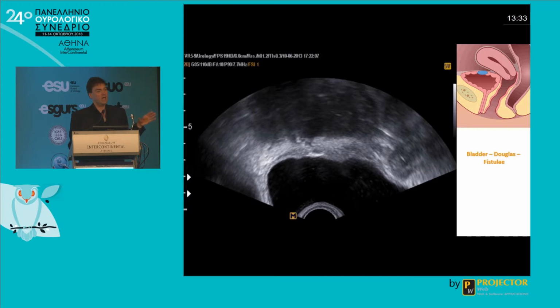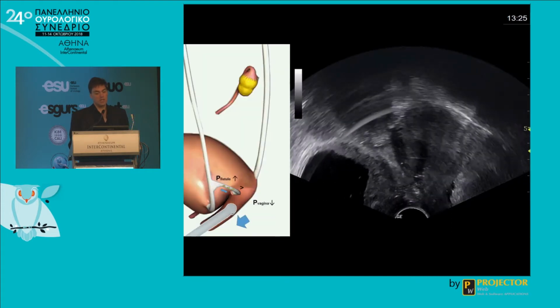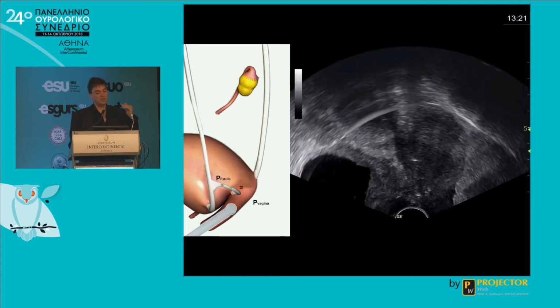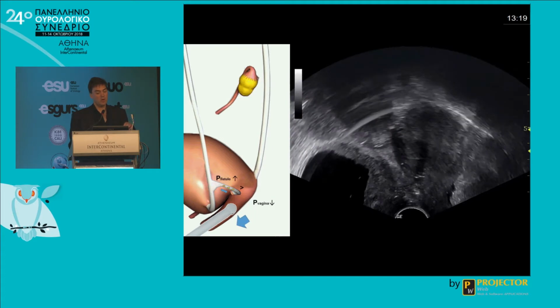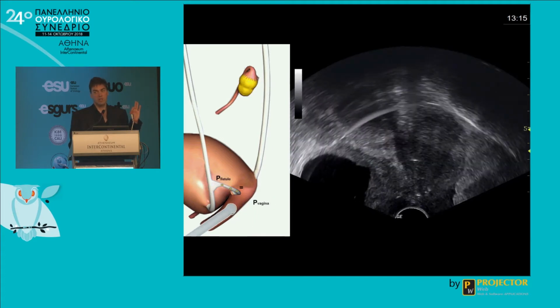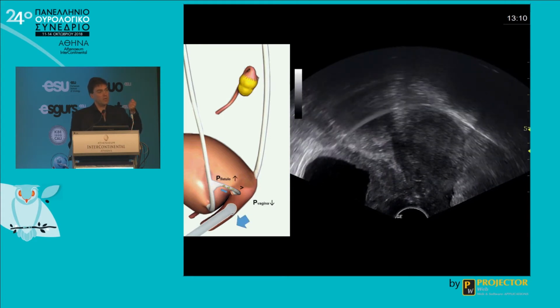You don't need any more X-ray and MRI. You can see it without any other diagnostic. Also here, this is a bladder cervix vaginal fistula. You see only a small spot, and the small spot is movement, only if you go forward and backward.